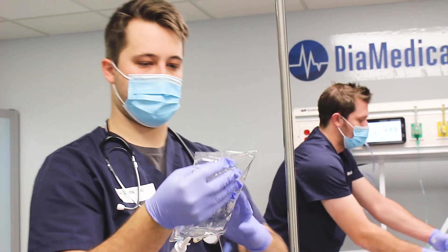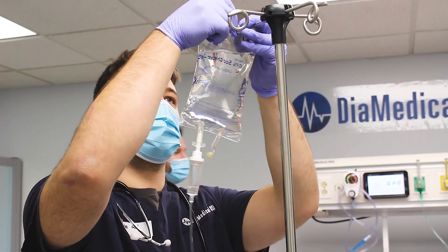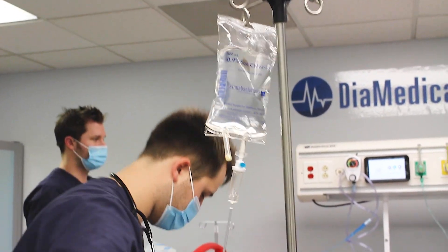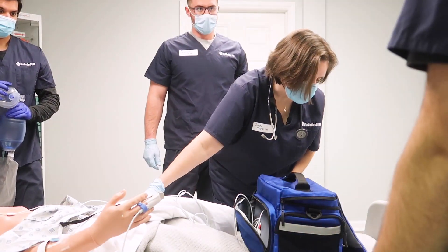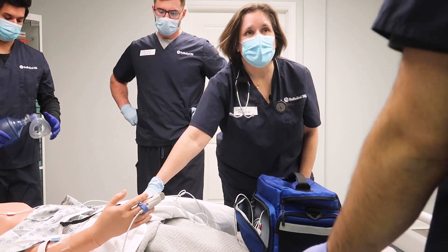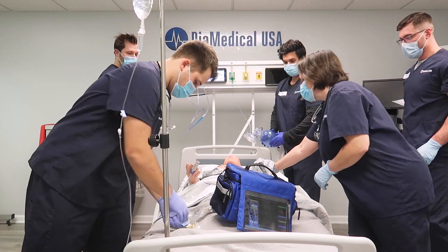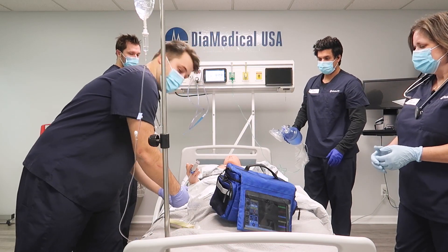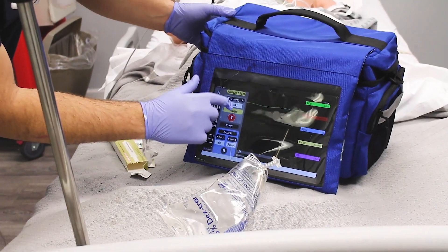Okay, let's hold up chest compressions for a second. He's in V-Fib. That's a shockable rhythm and he doesn't have a pulse. Let's defibrillate him now. Okay, sodium chloride is wide open. Charging.